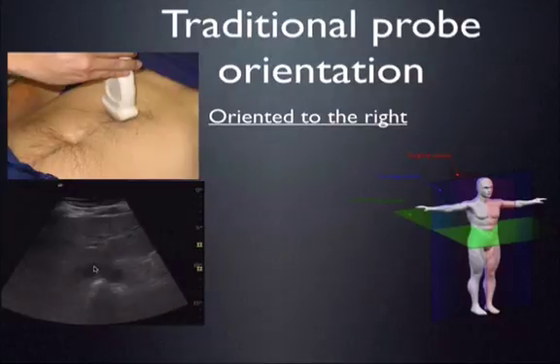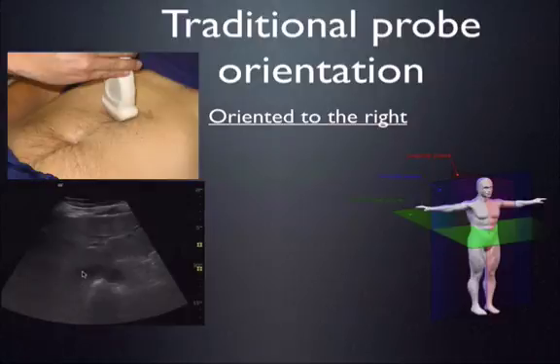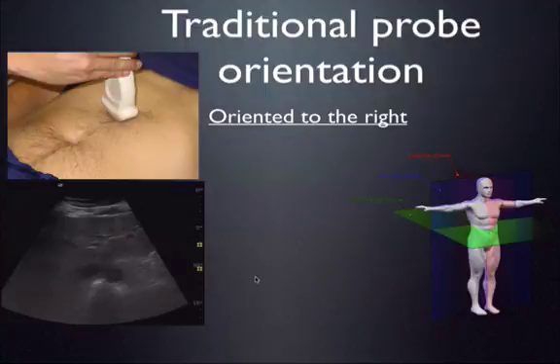The vessel on the left of the screen — the patient's right — is the IVC, because the IVC is positioned to the patient's right of the spine. The other vessel must be the aorta, since the aorta is normally positioned to the patient's left. Again, in this transverse plane we are standing at the feet looking up toward the head.